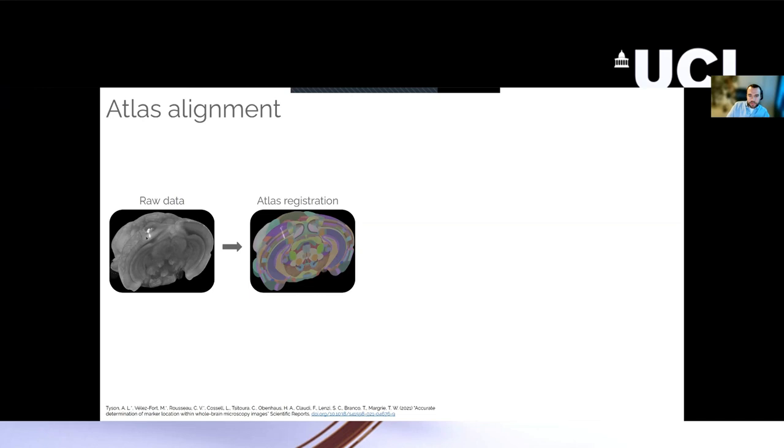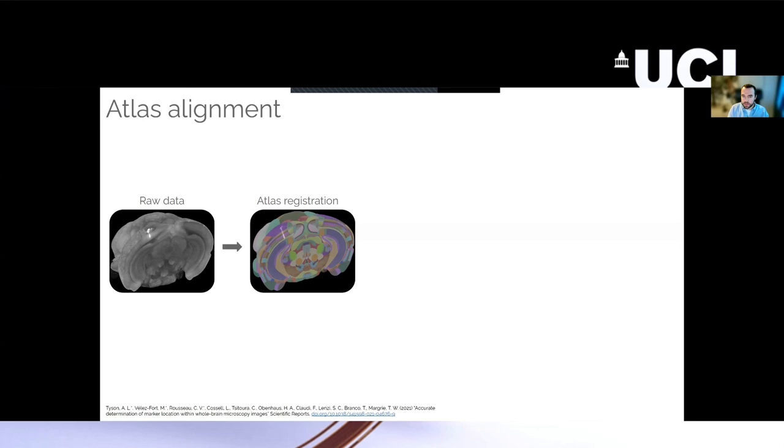By registration, we just mean we manipulate one image such that it overlaps another one. So you take your atlas image and the software will do some kind of rigid registration, things like rotation, translation, scaling, then some kind of affine registration steps like shearing, and finally some non-linear warping so that the atlas image will fit perfectly over your data. And then from here, even at a glance, you can see that your probe track is in a particular region of the brain.